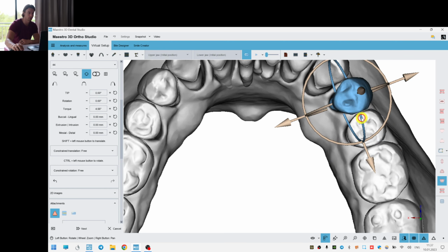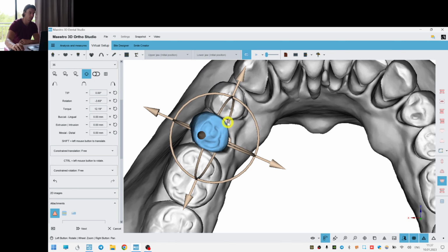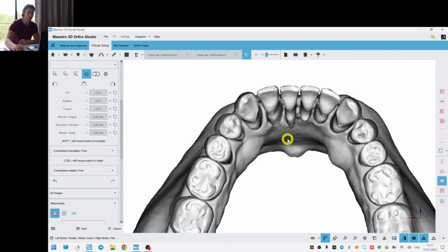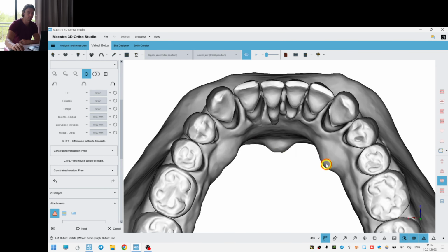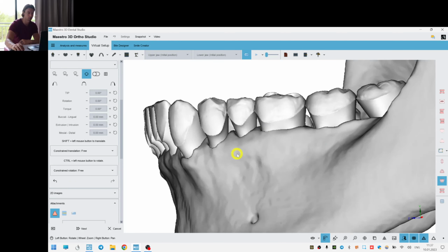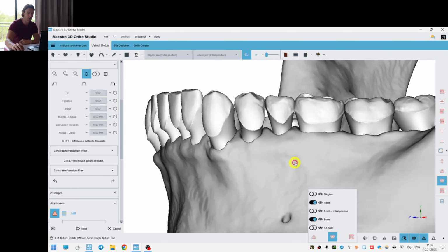So here we also add some distalization, some distal tipping. It's not a bodily movement in this case. By the way, pure bodily distalization usually doesn't work for the mandibula, especially for the roots of this size. Of course, it's just impossible to achieve the translational movements.